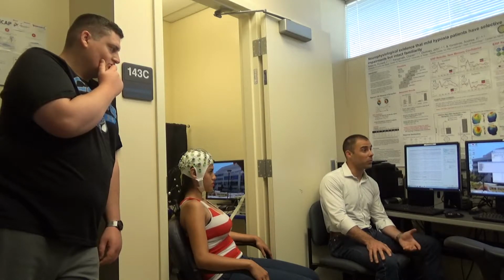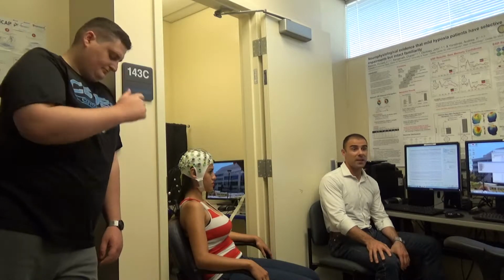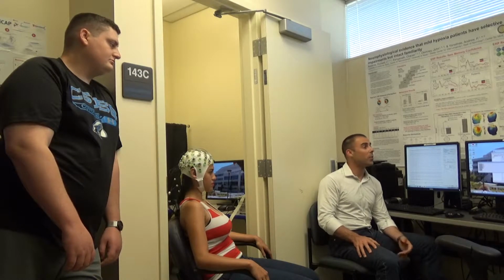Well, this is one really important way that we can do that, through good experimenter skills and keeping an eye on the data here and saying, oh, I noticed that maybe you were tapping your feet a little bit. Remember, it's a really good idea not to do that during the experiment. We need to try to stay very relaxed and very still. That way you can stop those trials before they occur, or at least minimize them if they do happen.